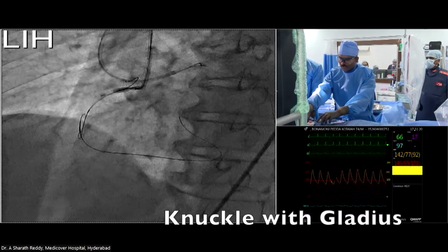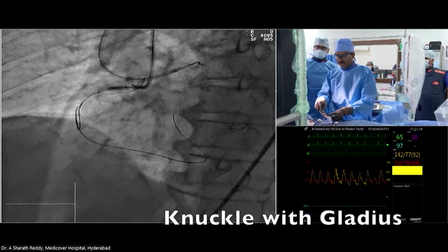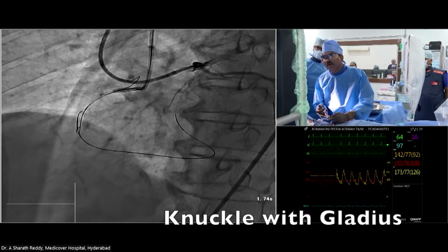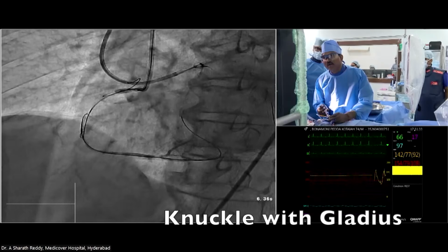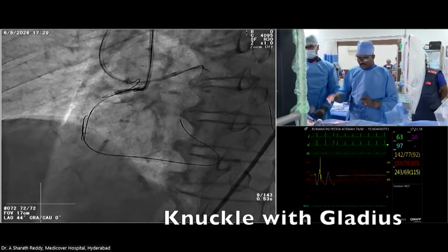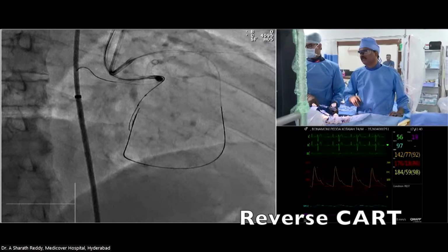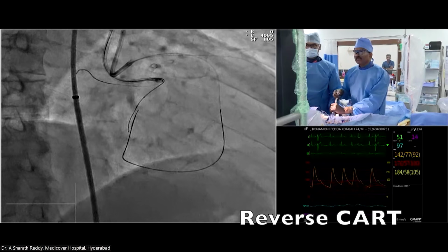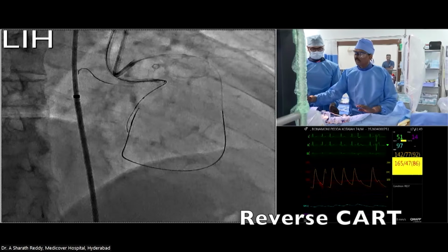To do that, I have to deflate and remove this balloon and remove the microcatheter, and bring a 3 mm balloon on your knuckled wire, and then start reverse CART. But it's also prudent to bring a guide extension, because there is a bend immediately proximal to the CTO.